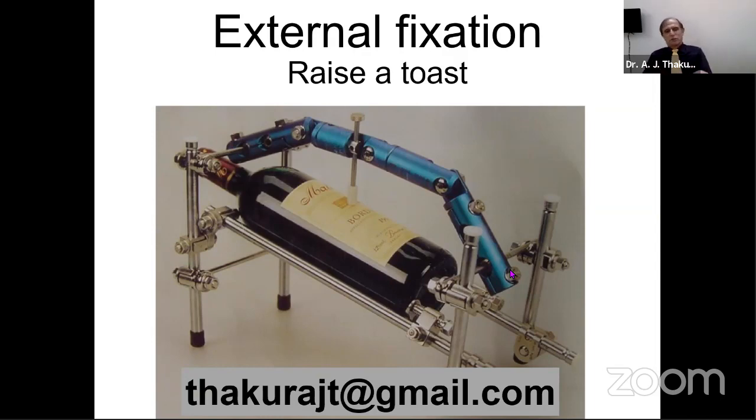It sticks to the pin, it also sticks to the skin. It also helps in reducing the movement at the interface. So I always use it, and so far no bad effects of that. And with my method, usually there is no oozing. Works very well. Sir, do you do this for upper limb and lower limb both, or only for upper limb? Mostly for radius ulna fixators.